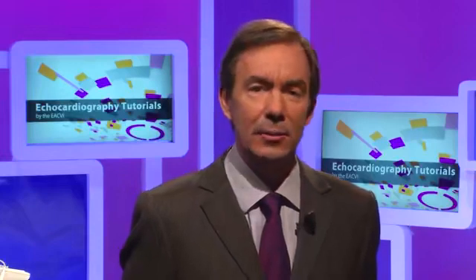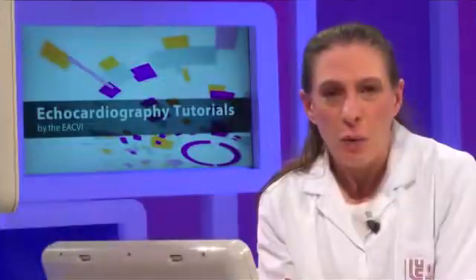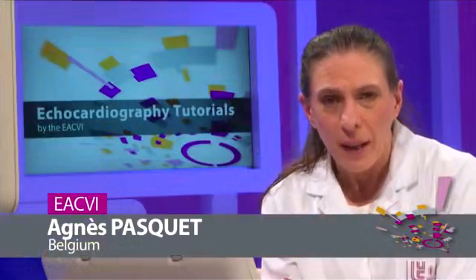Atrial septal defect is the most common lesion in congenital heart disease. It's often diagnosed late because of the lack of symptoms and physical signs. Agnès Pasquet will highlight how to use echocardiography to make the diagnosis, to establish the location and the relevance of the defect on hemodynamics. I will present you the case of a young man.